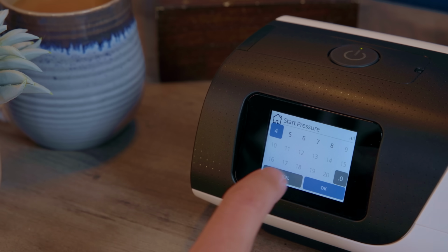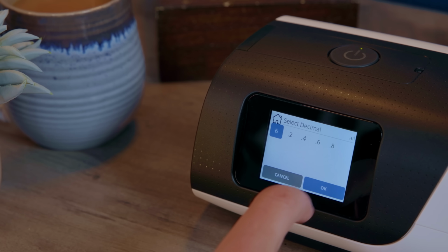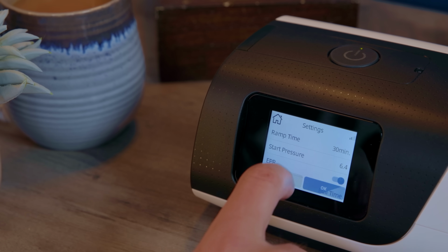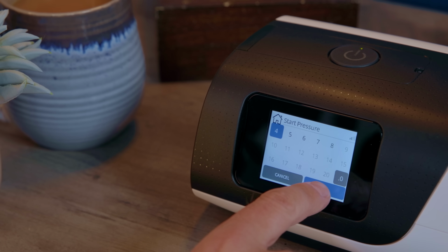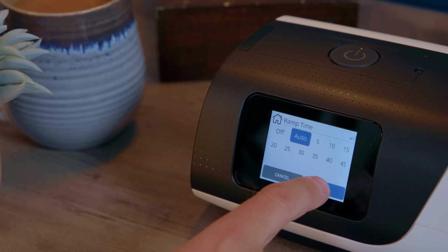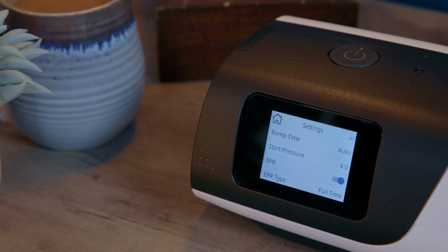Because ramp is only effective while you're still awake, it's a feature purely for comfort. You can change this as much as you like, and it shouldn't affect the quality of your therapy. So you can experiment here to find what's right for you. Our advice is to keep the start pressure as low as you can for maximum comfort, and to make sure that you either have it set to auto or to a manually set time that won't mean that you're still in ramp mode after having been asleep for more than 10 minutes or so.